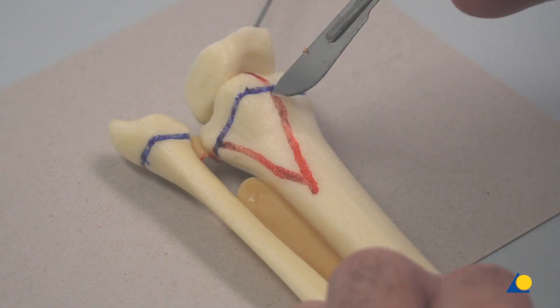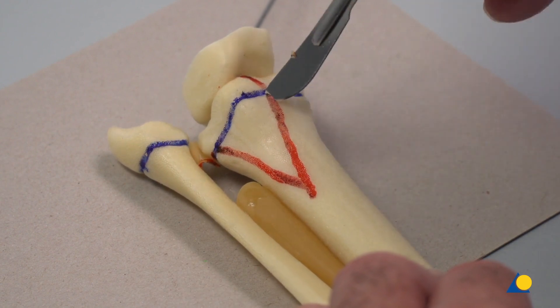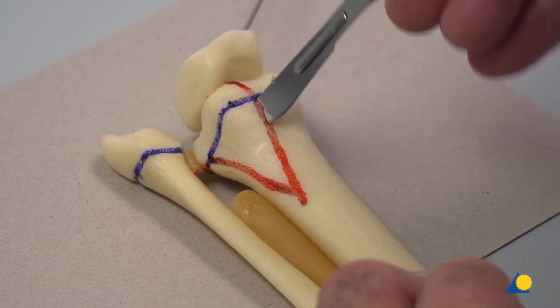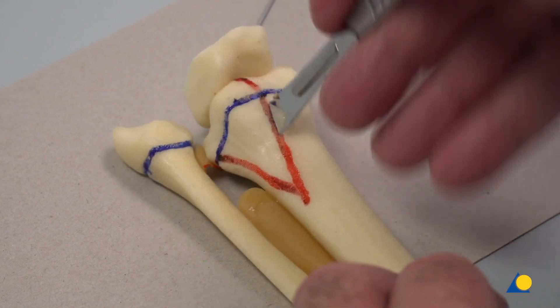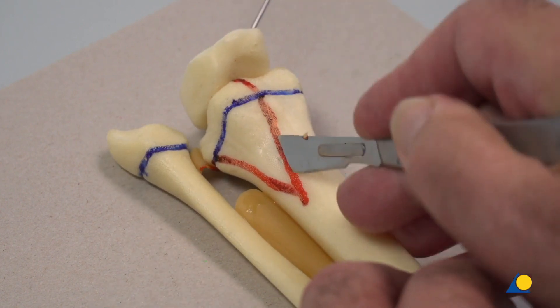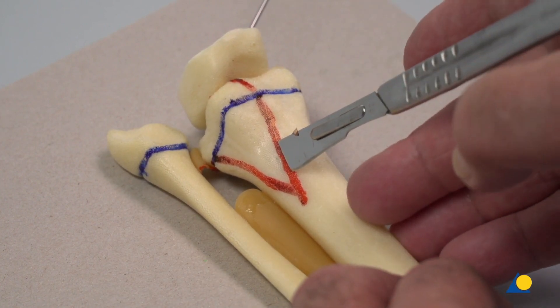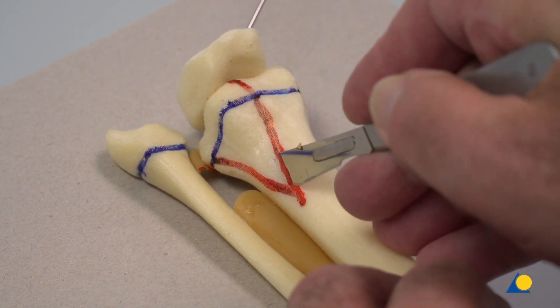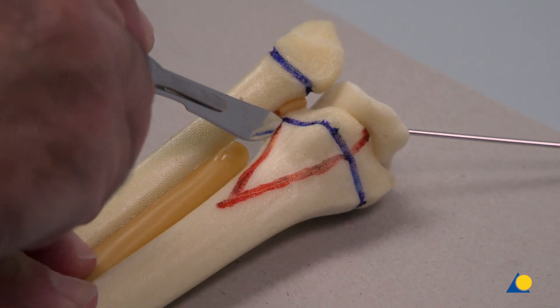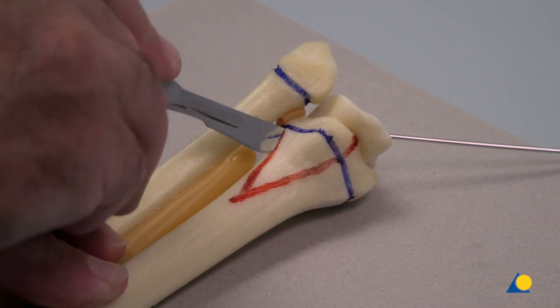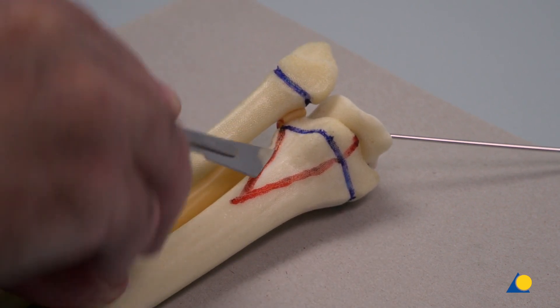On the posterolateral aspect, starting at the level of the physis, a metaphysial fragment is produced in a cranial direction and completed with the cut through the red line on the medial side of the metaphysis. The scalpel is held slightly oblique so that the cuts will converge. The bone must be cut deep enough on the level of the physis to achieve the correct fracture pattern and avoid breakage of the metaphysial wedge.